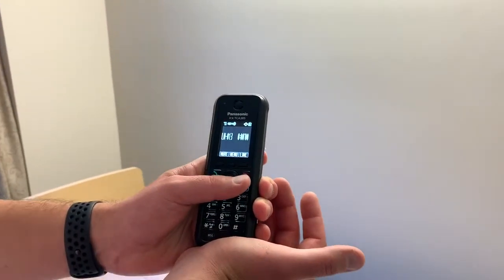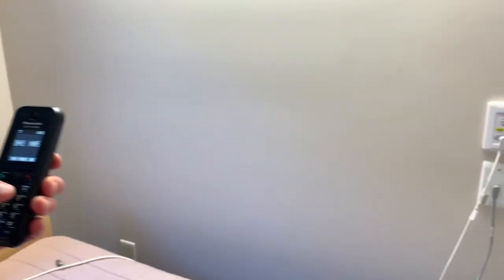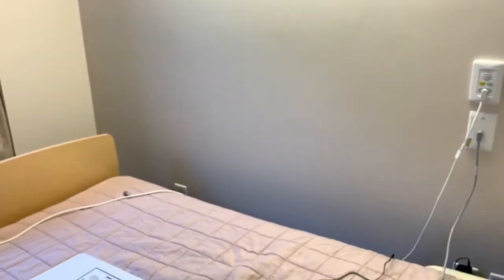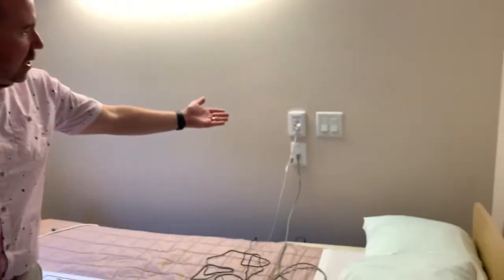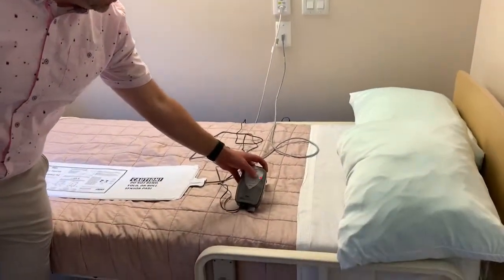So I can answer this, and I might get a bit of feedback because I'm in the room, and I'm going to hang it up. We could have been able to talk to the resident through there. I just didn't for the video. So you're going to come in the room. Maybe the resident's standing up. Maybe they're halfway out of the bed. Attend to the resident. You're going to see that this cancel light is blinking, and also the light on here is blinking, showing that it went into alarm.